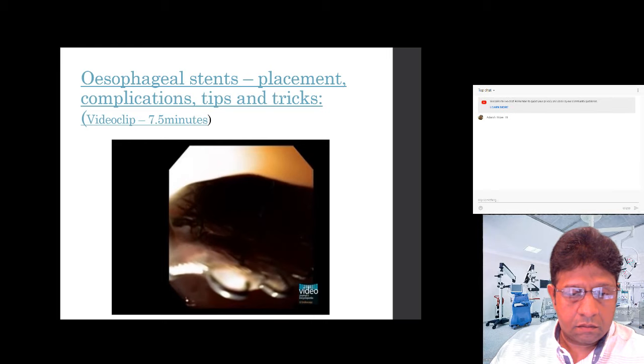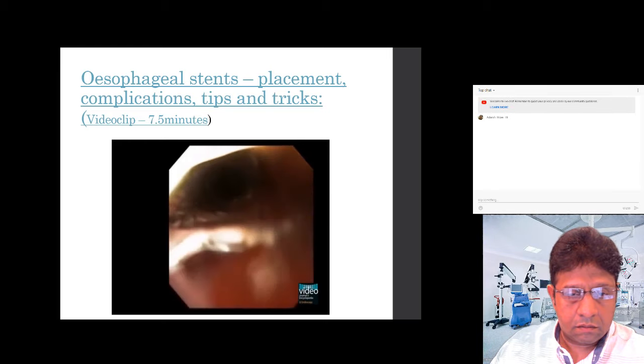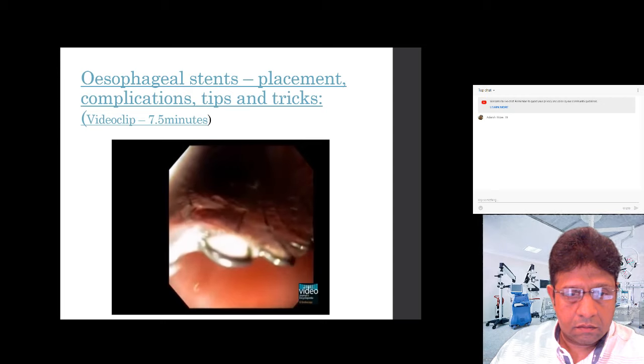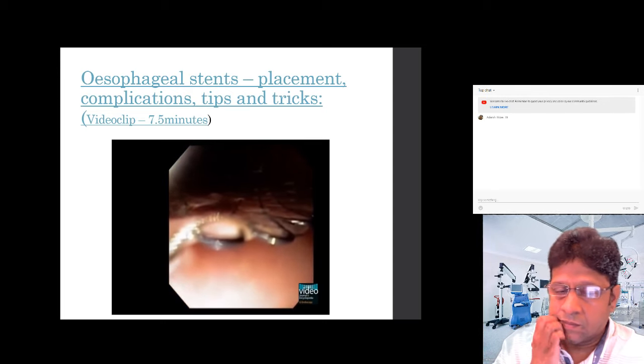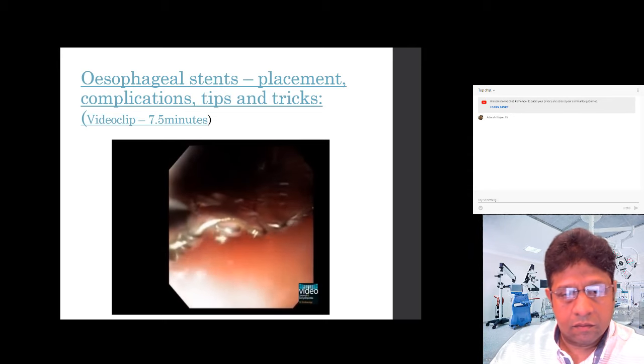When the stent is felt to be in adequate position, the rat tooth forceps release the stent and the position can be directly assessed endoscopically. If satisfactory, no other adjustment is required.